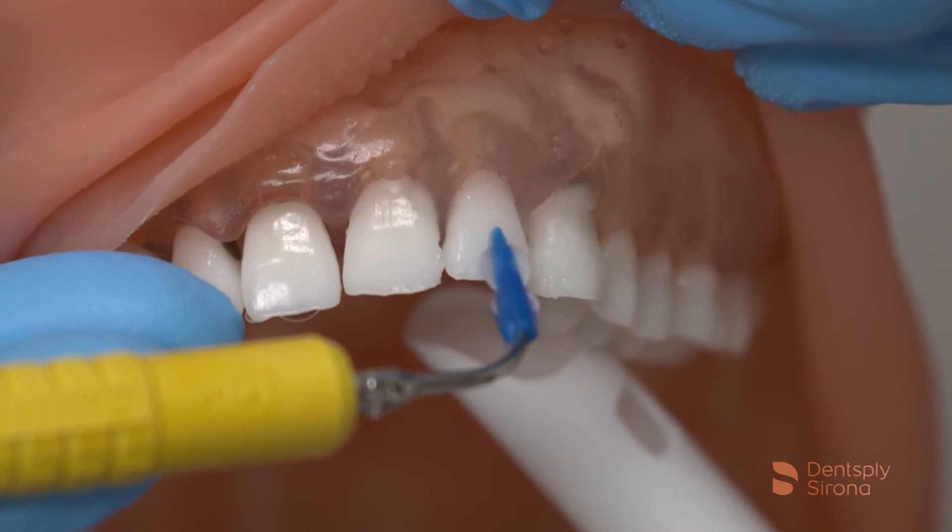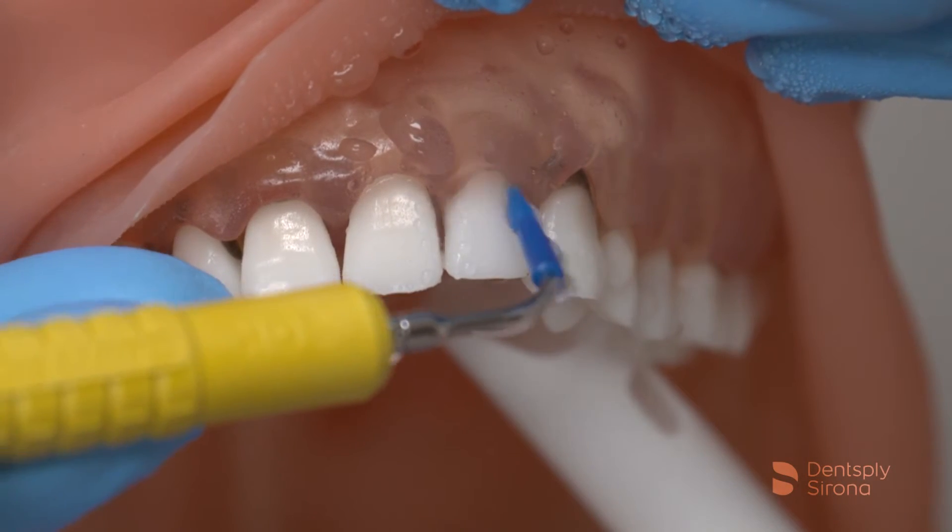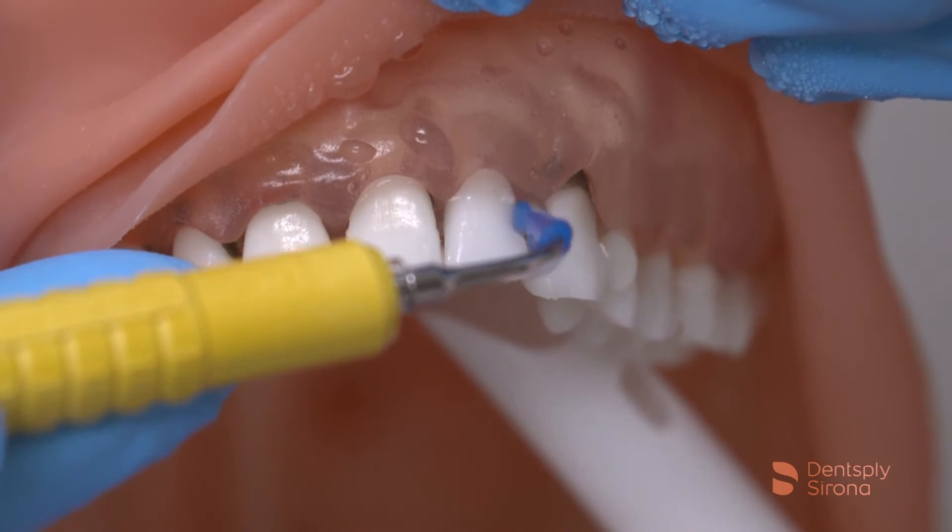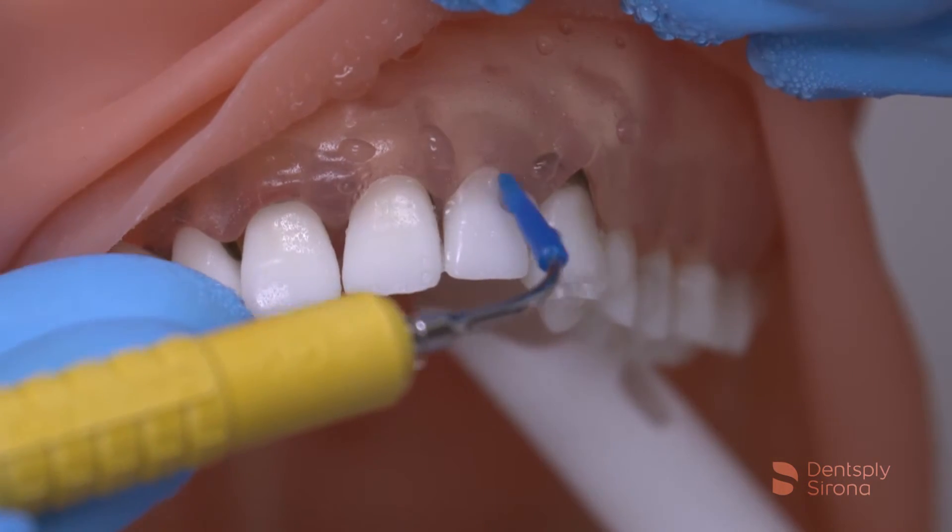Dental implants and their titanium surface need additional consideration when choosing the proper debridement instrument. The sulcular environment and the mucosal seal is more fragile than the normal tooth and this requires a gentle approach and care when debriding in the sulcus.